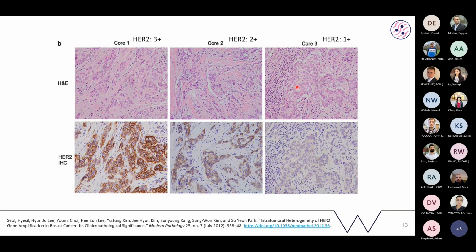That makes HER2 more challenging to be predicted. Exactly. Question. I've been wondering why we don't just find HER2 directly on an H&E also? Because HER2 is expressed in the membranes of cells, and membranes are lipids, which are essentially uncharged. So neither eosin nor hematoxylin is going to bind there. So you'll not be able to see much of the membrane within these images. And you can also use other fluorescence techniques, but I'm going to stop here.